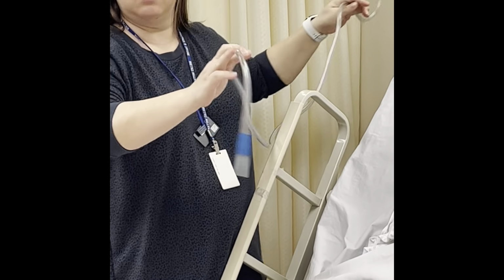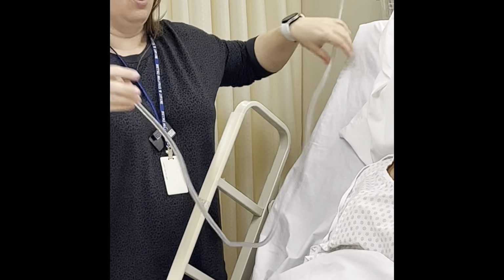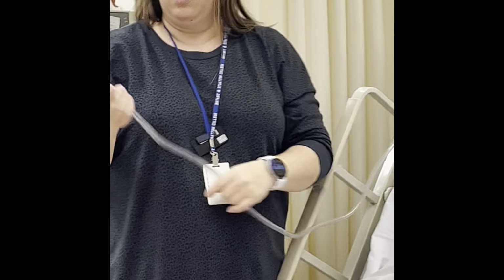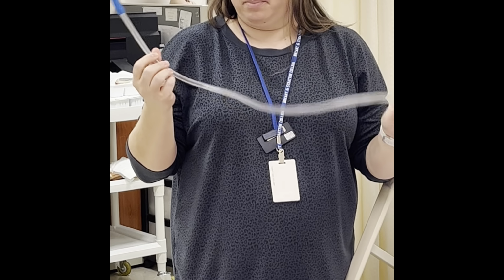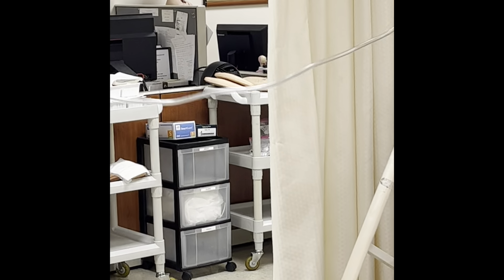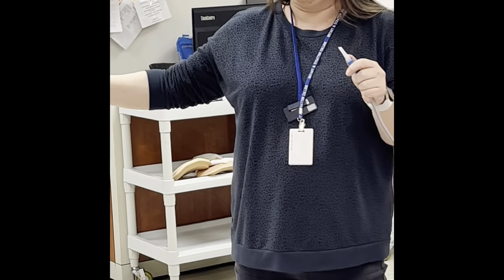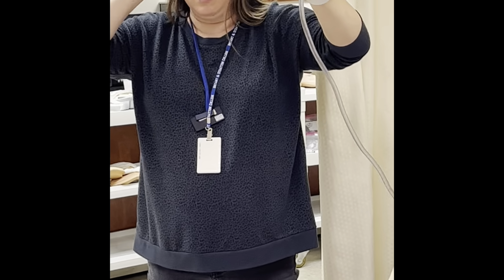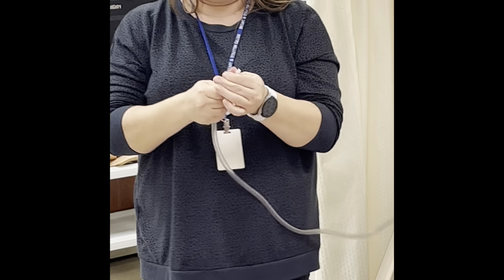Because we're not gonna hook our patient directly up to the vacuum, we need some space. I would suggest in real life, we normally put like 2 or 3 of these so our patient can move around. This is like your patient can only walk this far from the vacuum, like a radius around the bed. If they needed to go to the bathroom, we can keep them on the vacuum, we just need more of the tubings.